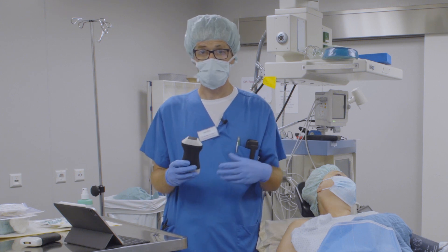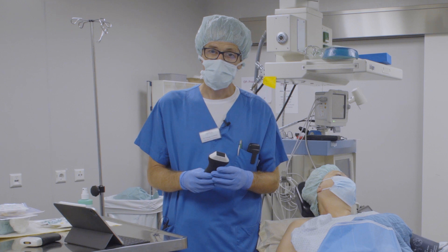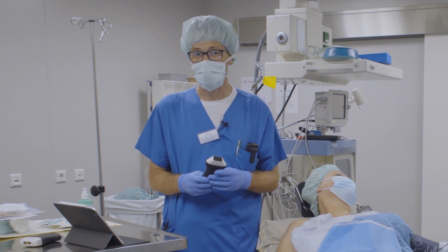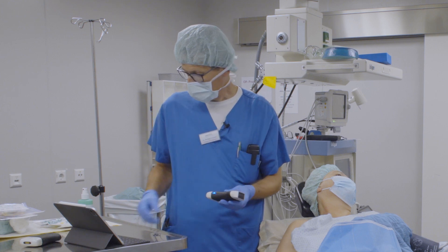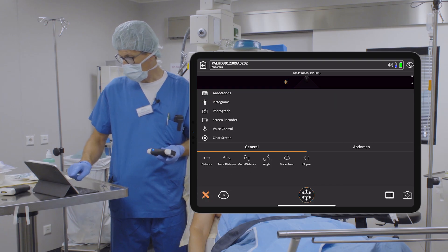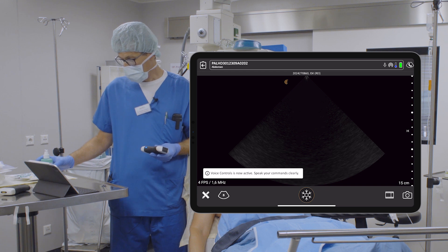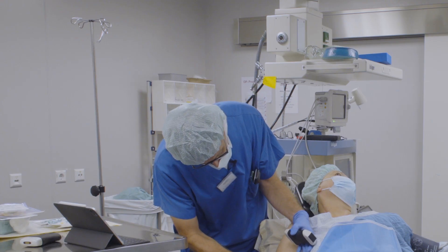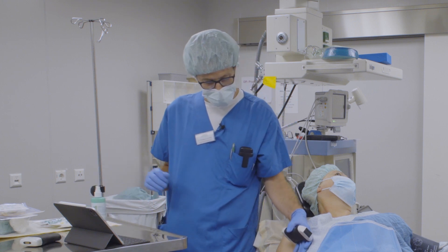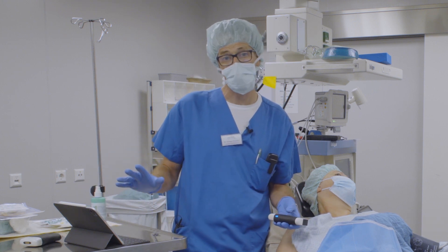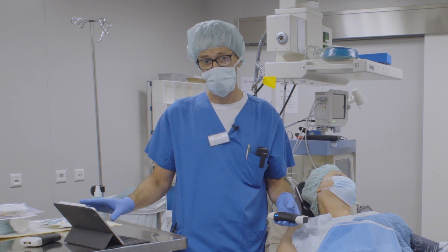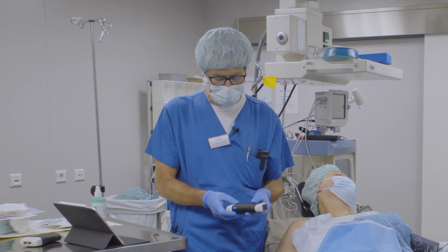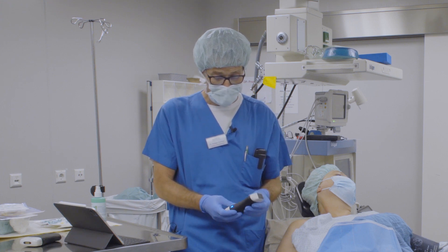We will also assess diaphragmatic function after the block, because there are quite a few hemidiaphragmatic paralyses after the interscalene block. The app on the iPad is easy to use — I've activated voice commands so I can run settings and image optimization via the touchscreen, buttons on the scanner which I can customize, or by voice control.